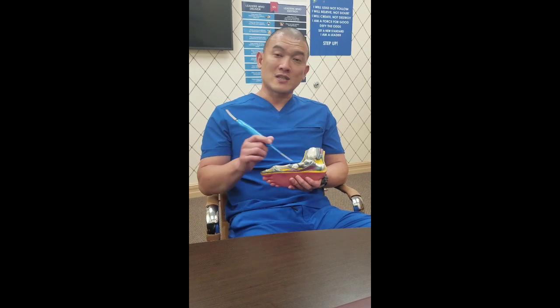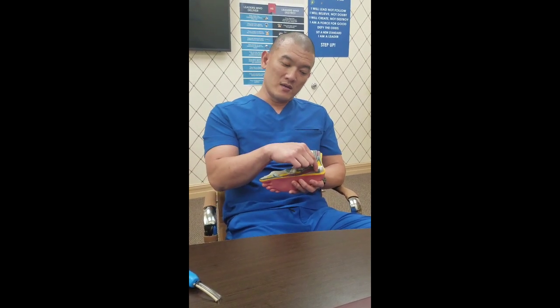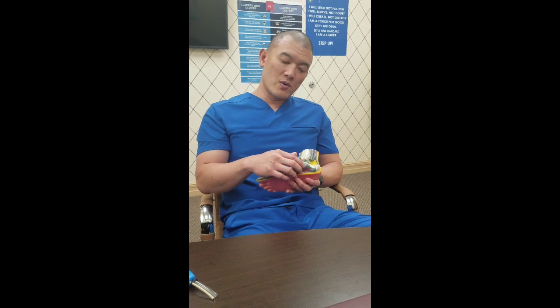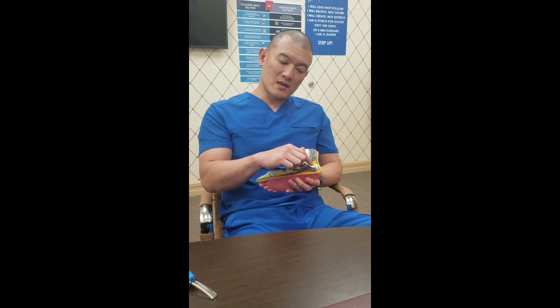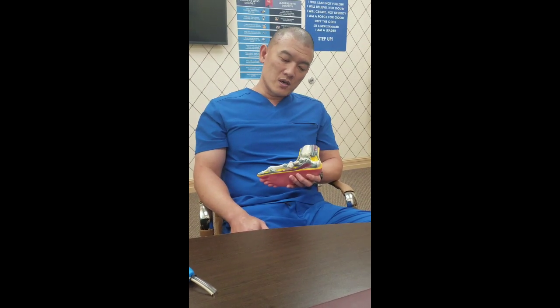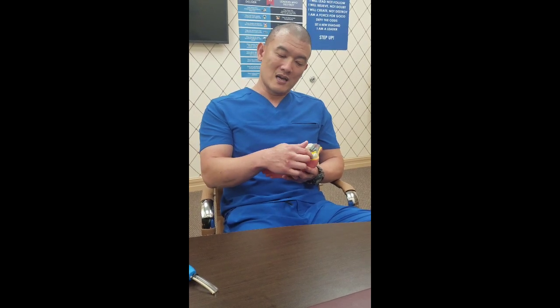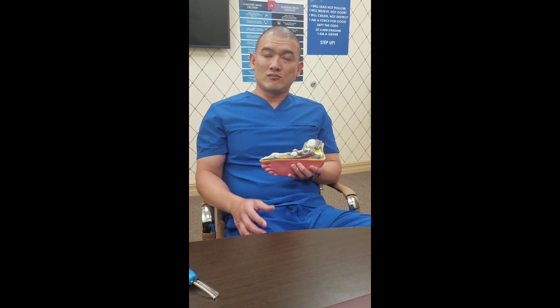Well, we have endoscopic surgery where we take a little 4mm camera, go in, and we cut the band. The other way is a minimally invasive opening, but we still cut the band with scissors. Small opening, we're able to cut with scissors. The other option is the traditional. We open up the bottom, look at it, and we cut the band. So everything we do is cutting the band. Whether you do it by camera, by opening, small incision, big incision, cutting the band.